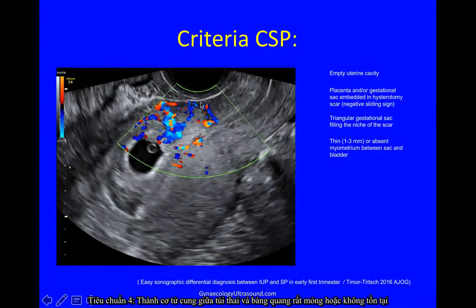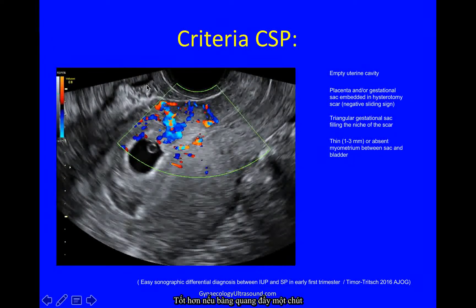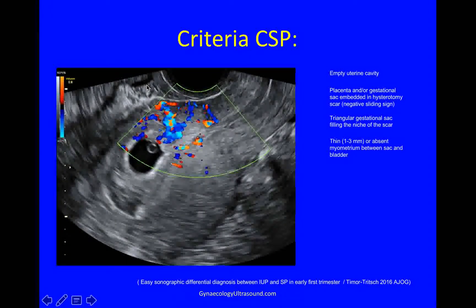A thin or absent myometrium between the sac and the bladder. In this case the bladder is empty — it's better if you have it slightly filled. I'll show you a good video in a minute.